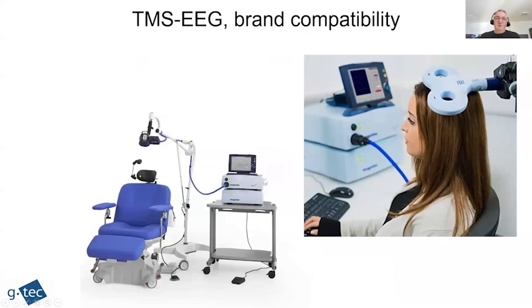You would usually have a setup with a chair, which is quite comfortable for the subject. Then we would have the arm, which enables better positioning of the coil, so that you can secure it for a longer time without doing it manually.